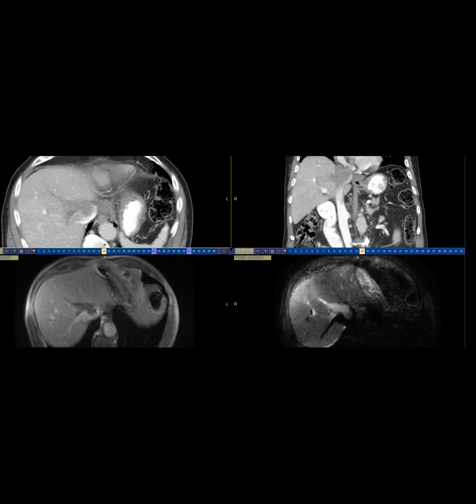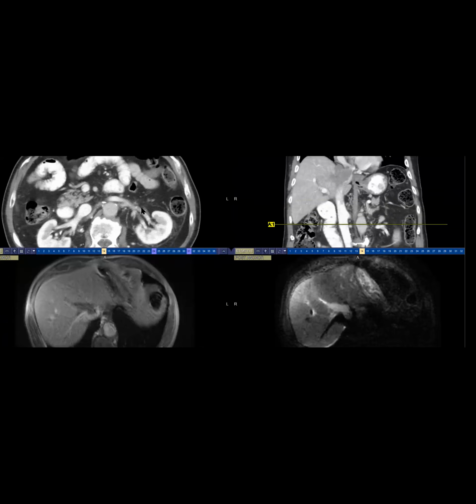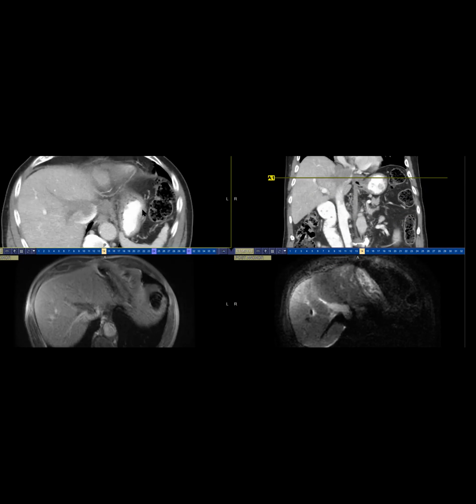Wow, did the patient have lymphoma elsewhere? Or that was the only spot? No, so that was the interesting thing. No lymphadenopathy, no disease elsewhere. Definitely a diagnosis of exclusion. Yeah, definitely.